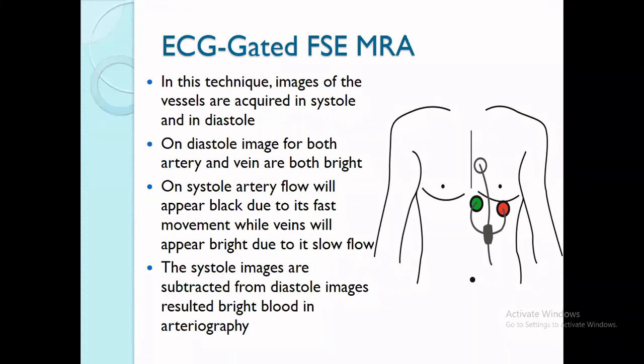for example, you are taking the right ventricle or left ventricle. It's up to you. For example, if you are measuring for the main pulmonary artery, you will have to consider the right side of the heart, which is the right ventricle. If the right ventricle takes up the blood, it reaches its maximum capacity. We call it the diastole. And if the contraction happens, we call it the systole.